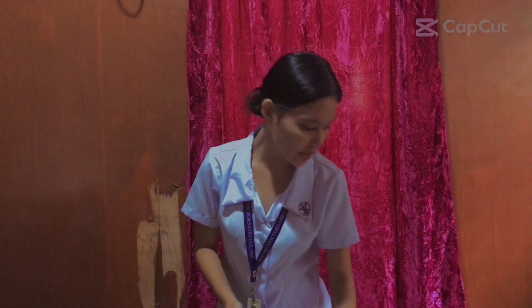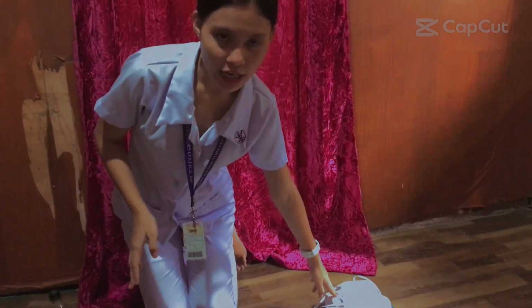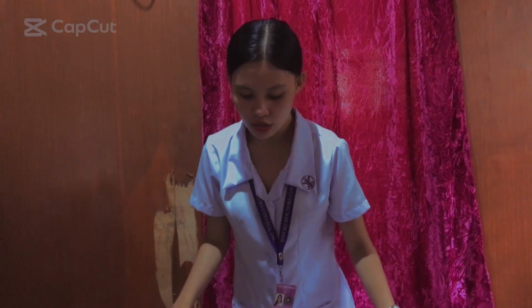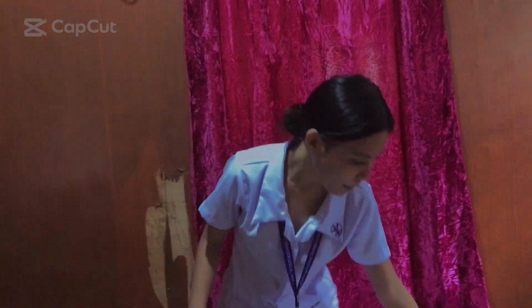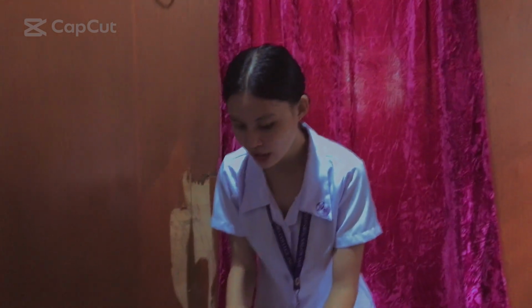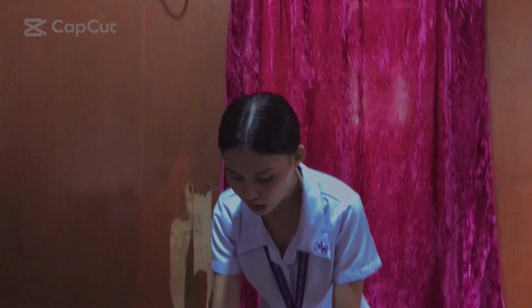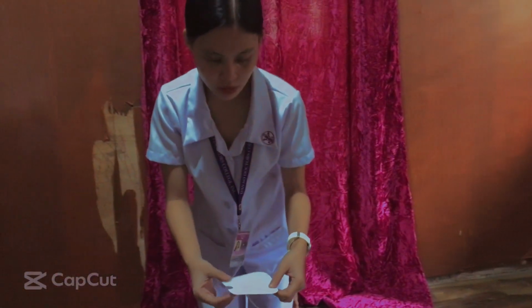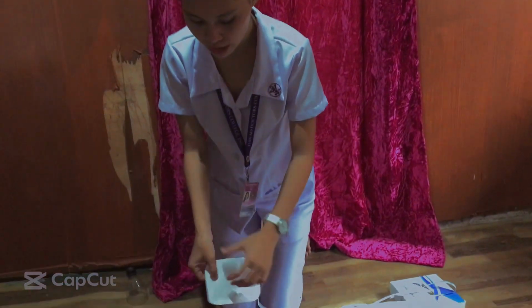Now, assuming that I am the second rescuer, I am going to turn on the AED, and I'm going to scan the abdomen and the chest of the patient to see if it is hairy or if the patient is soaked in water. If there is nothing on his chest, we're going to proceed to put the patches on the right side of the patient, just above the nipple line. And next I'm going to put the other one on the left side of the patient, just below the nipple line.